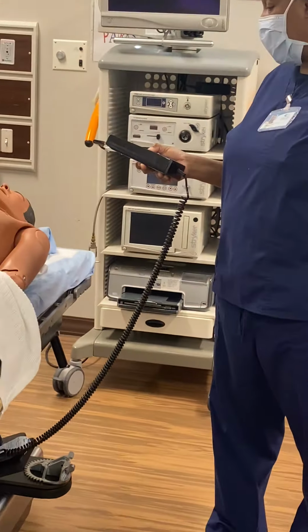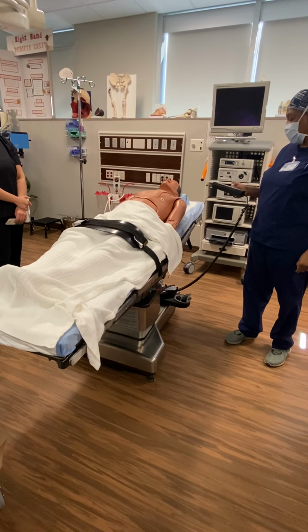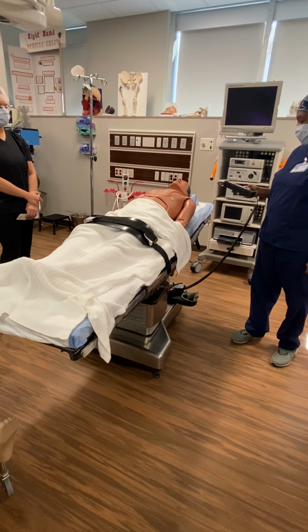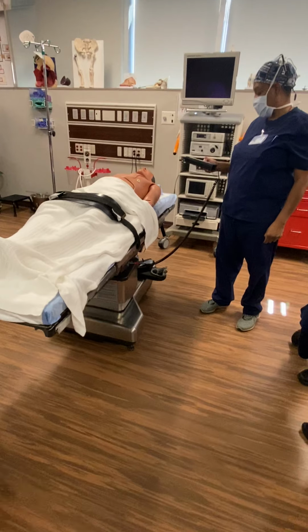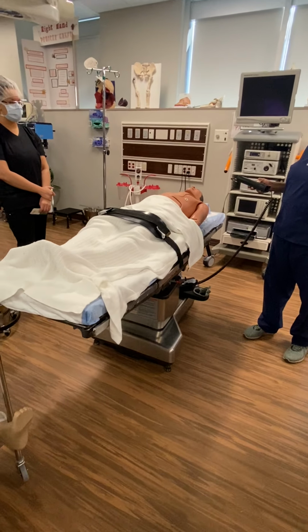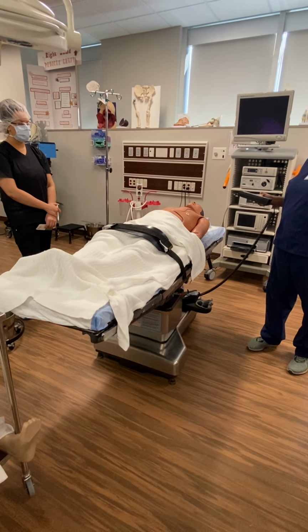So never strap the shanks, okay? Do you know how easy this would be to come out from under? All he's got to do is bend his leg, because it's under his knee. If he bends his leg, it's going to come down and out. So always over the thigh.